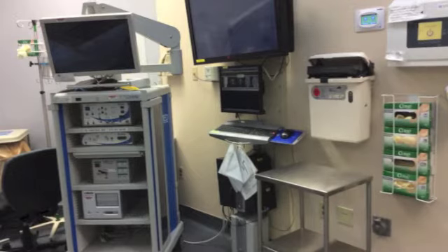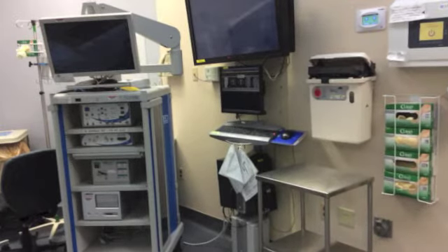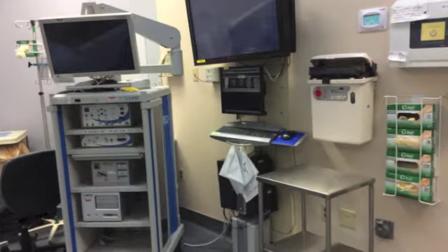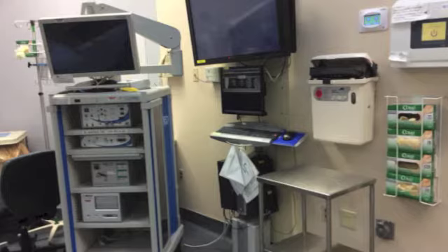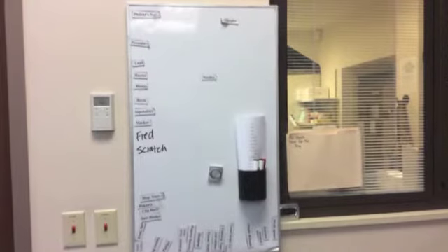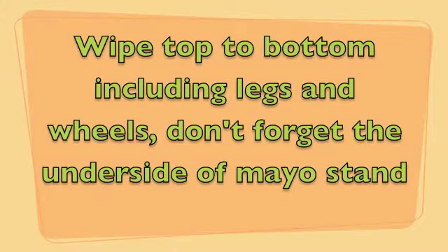Specialty equipment, furniture, and positioning devices should be wiped clean with approved solution, paying special attention to surfaces that face the surgical field with the highest risk for splash. If not needed for the following case, move to the hallway or put away in the proper place. Clean and disinfect all equipment, Mayo stands, back tables, ring stands, kick buckets, and prep tables. Clean tops, sides, lower shelves, and base.